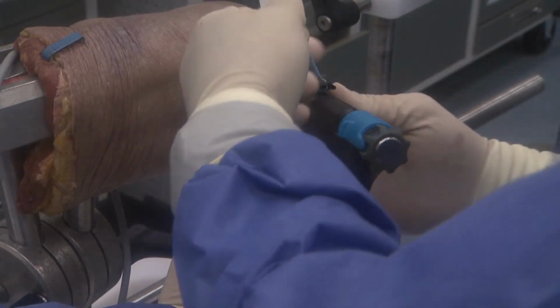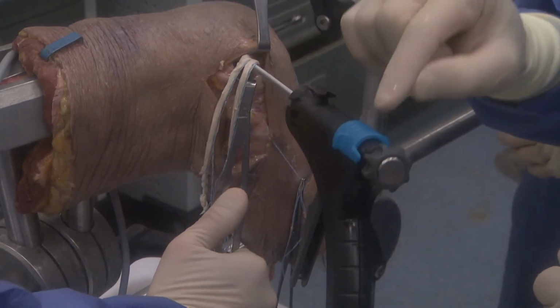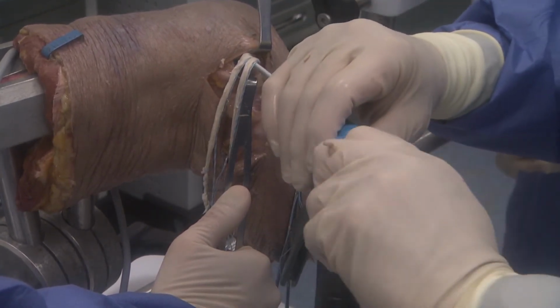Now I can uncleat my tendons, and to remove the insertion device from the implant, I slide this blue handle forward and I unscrew this.